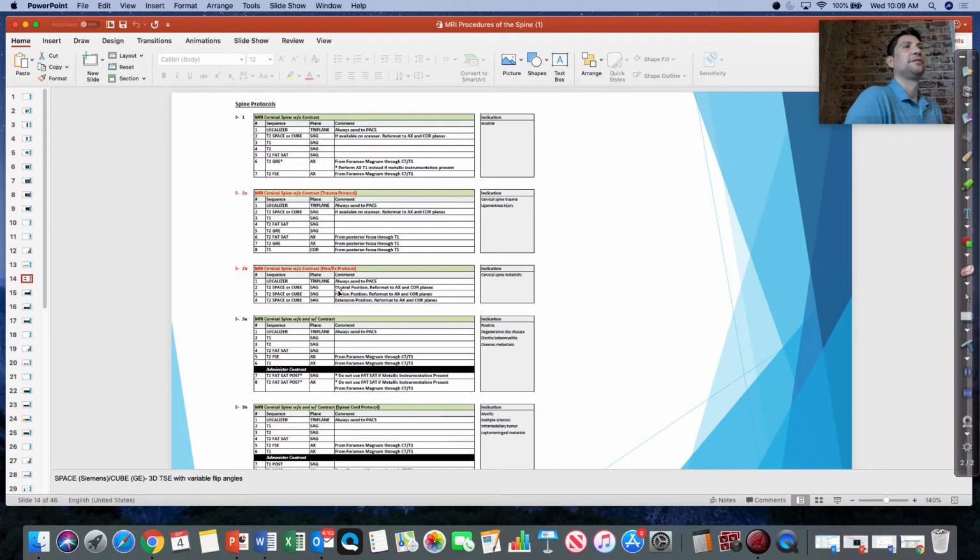Instability, spondylolisthesis, right? That fancy word for instability, where your vertebral bodies, there might be a fracture within those facet zygapophyseal joints, and it could cause some stability issues when you flex and extend the neck. You can also do that in MRI, but they have to hold it for 3 minutes. That's tough. Yeah.